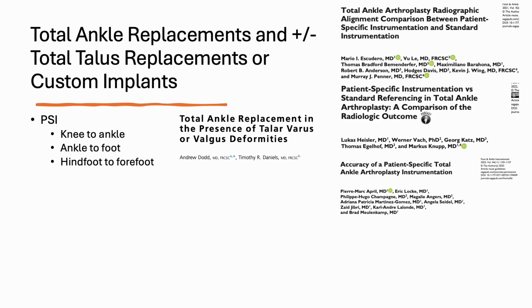But what I find is the most important is that patient-specific instrumentation is accurate, so you can trust it. And then second of all, if we can get a weight-bearing CT scan, can we help get better outcomes?